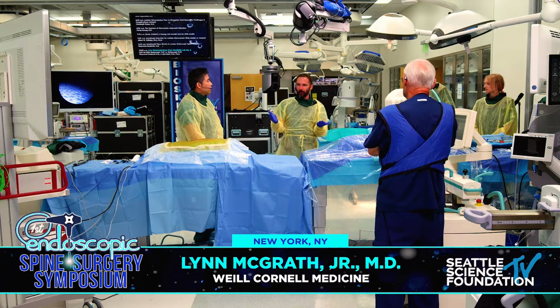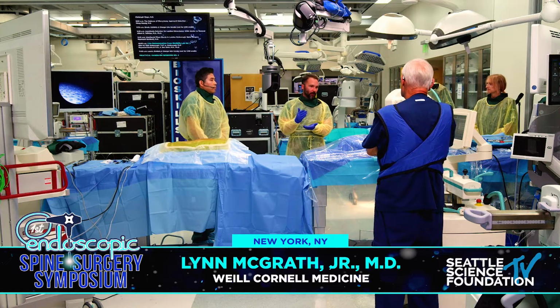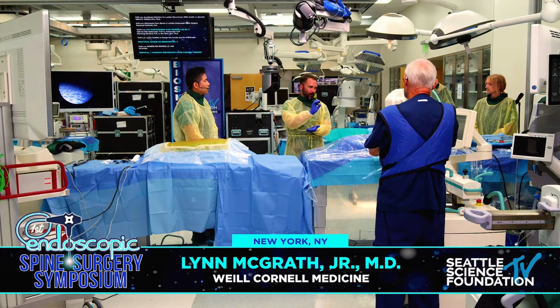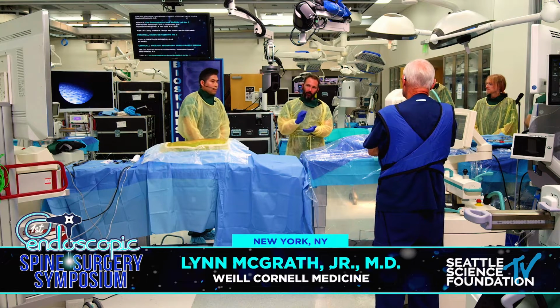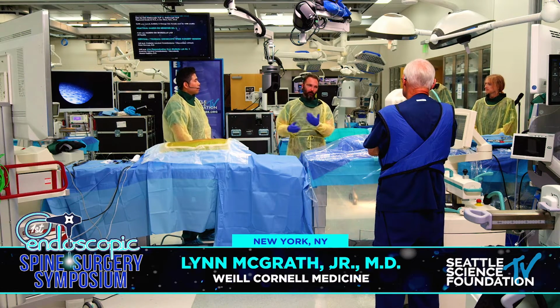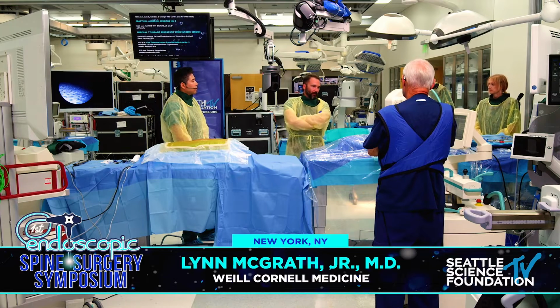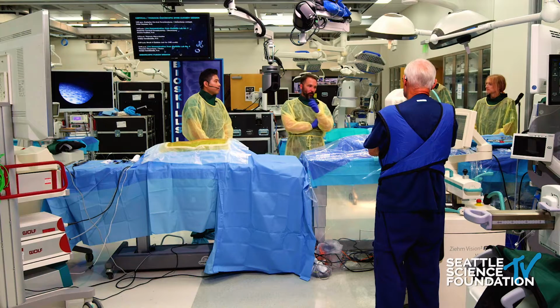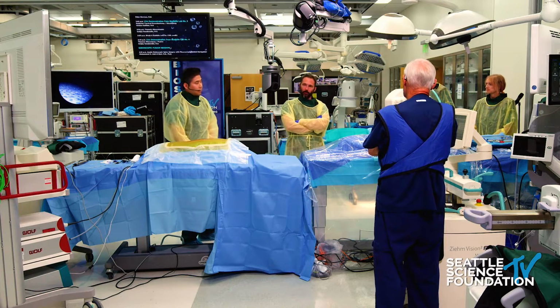Most of the time I'm navigating these at this point because I think it's easier and quicker to navigate the dilator and to be able to check over the course of the case without having to bring x-ray in and work around x-ray. I found that easier. But when I'm doing it with fluoro, I do it exactly the way Osama just did.